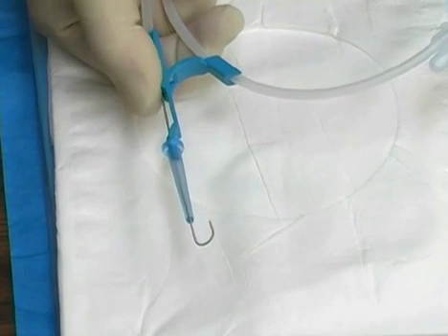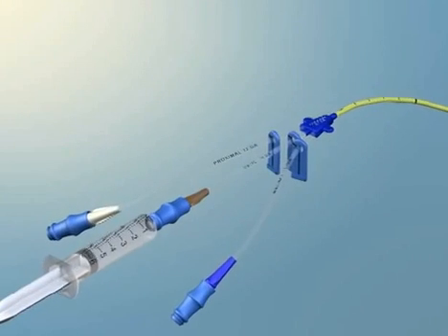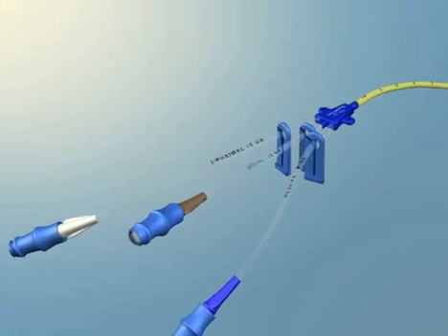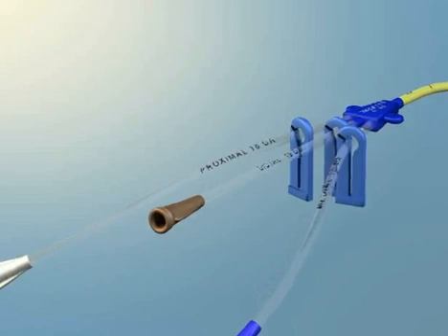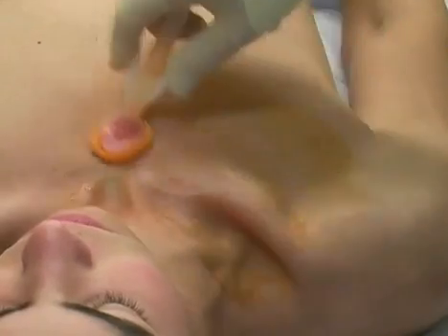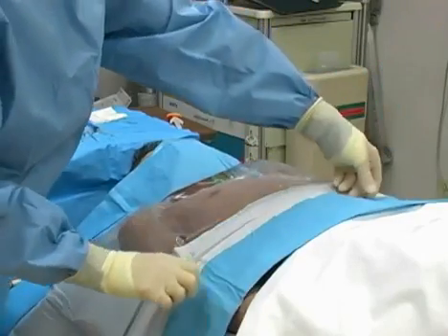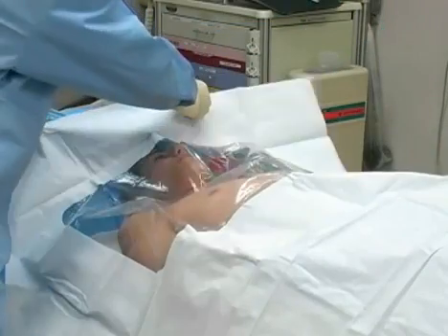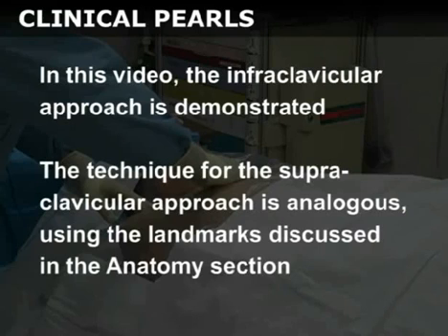Test the guide wire to make sure that it feeds easily through the straightener sleeve and then retract it before proceeding. Pre-flush the ports of the triple lumen catheter with normal saline and leave the cap of the distal port removed so that the guide wire may be advanced through it. Cleanse the skin overlying the entry site with a chlorhexidine applicator covering a wide region. Place the sterile fenestrated drape over the procedure area. Note that a large full body drape should be utilized to reduce the incidence of iatrogenic infection. In this video, the infraclavicular approach is demonstrated. The technique for the supraclavicular approach is analogous using the landmarks discussed in the anatomy section.